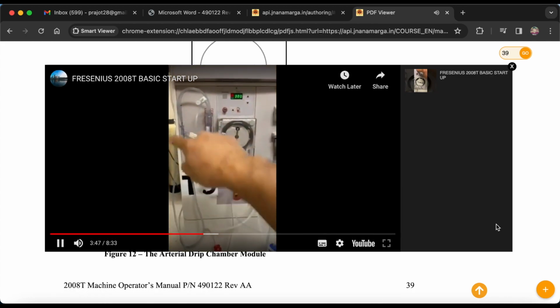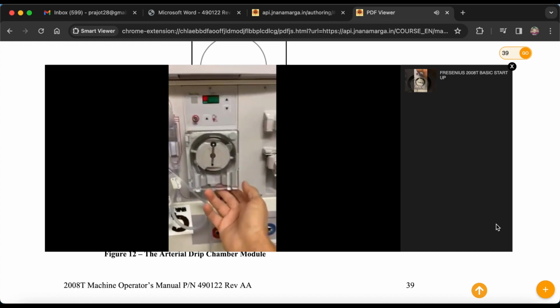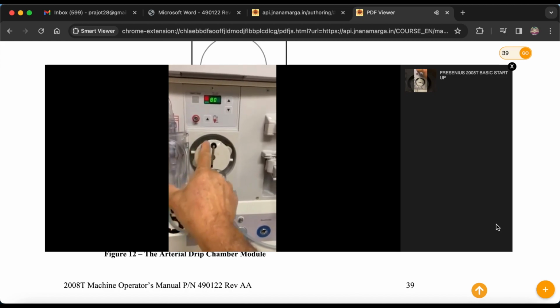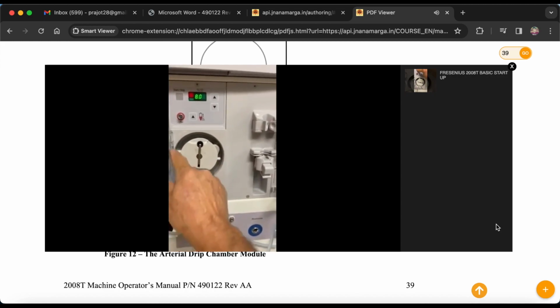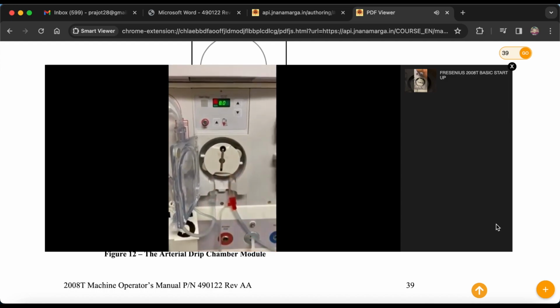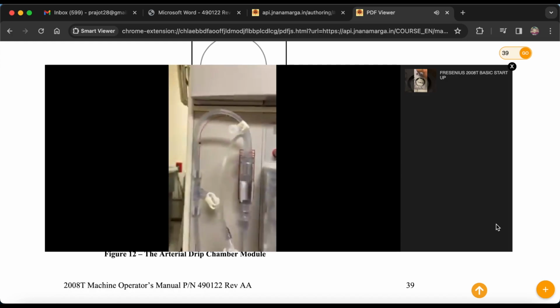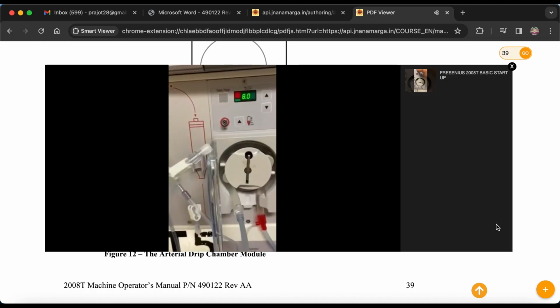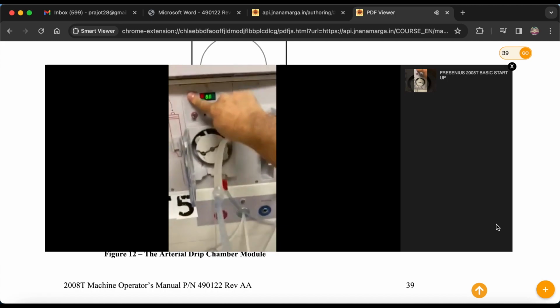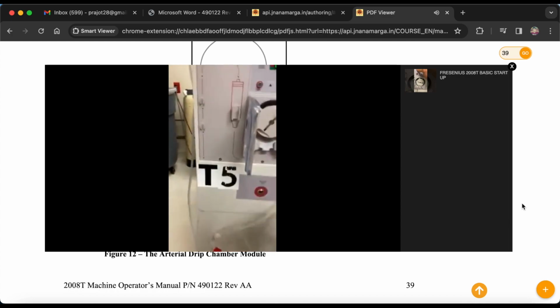We've strung our machine so we have our arterial line coming into our blood pump. This is what I want to point out more than anything. This rotor in the blood pump, very critical. These lines go in and around the blood pump. These guides guide the blood through the blood pump. Now, if we want to pull this out, we need to hold the tubing a little bit with our hand, not a lot, just a little bit, and press the button. This will rotate the guide, pulling the tubing out. Same thing if we're putting it in. So we put it in the same way.